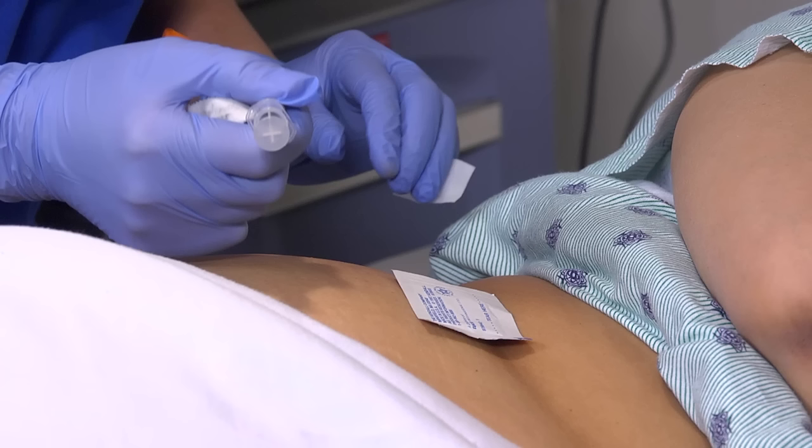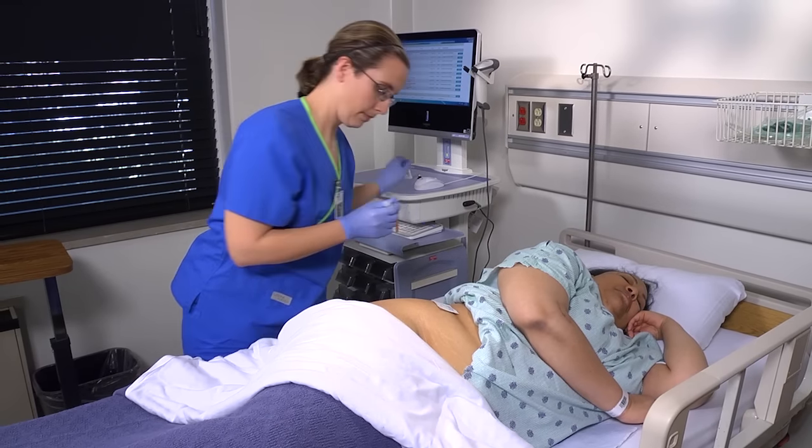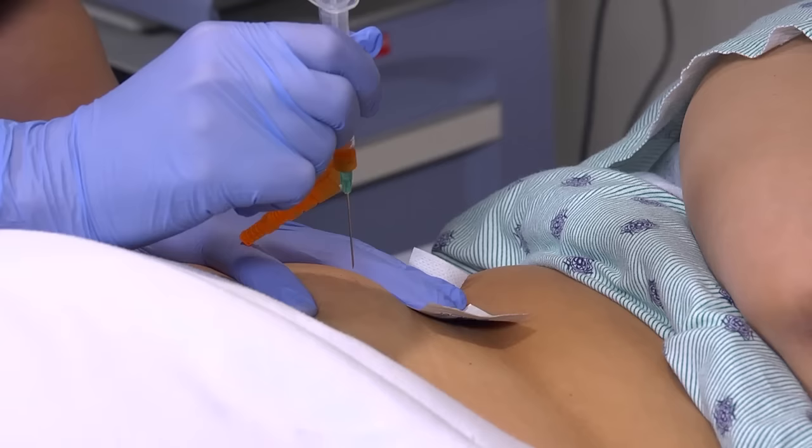Hold a gauze pad between the third and fourth fingers of your non-dominant hand, and remove the needle cap or sheath by pulling it straight off. Hold the syringe with the thumb and forefinger of your dominant hand, as if it were a dart. Remind your patient to try and relax. Place the ulnar side of your non-dominant hand just below the injection site, and pull the patient's skin laterally about one to one and a half inches, or two and a half to three and a half centimeters. Hold this position until you've inserted the needle.